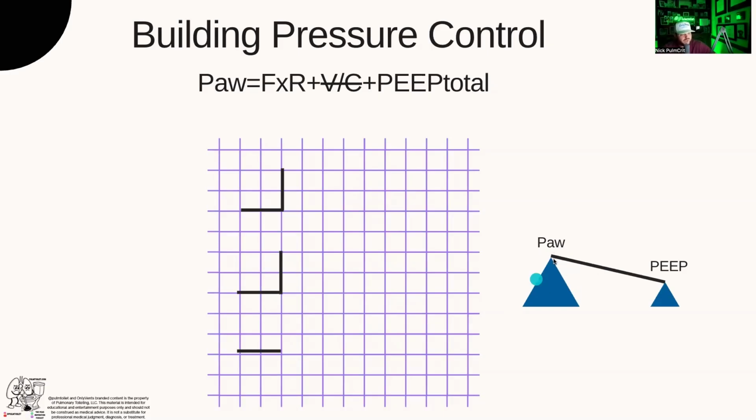So this is my way to depict the pressure difference. Your airway pressure is much higher than your PEEP. Therefore, the bigger triangle is sloping towards a smaller triangle. And this should probably be P-alv, not PEEP. But that's what I set up: two different pressures.